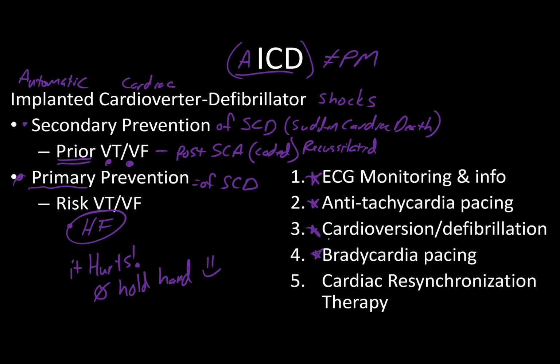Bradycardia pacing. In this scenario, it is entirely possible for a patient to have a pacemaker and an AICD. That's a very common thing, and an important question to ask: do you just have a pacemaker, or is it capable of delivering a shock? Sometimes patients know, sometimes they don't. But if you're looking at the records and can figure that out, that's very helpful. And the combination of the two is absolutely excellent for patients who have very poor heart function.